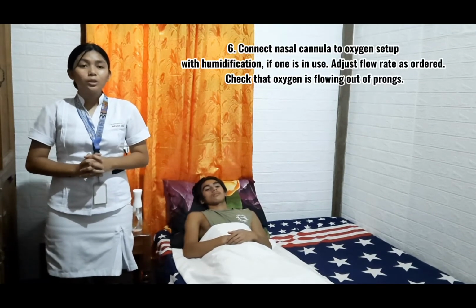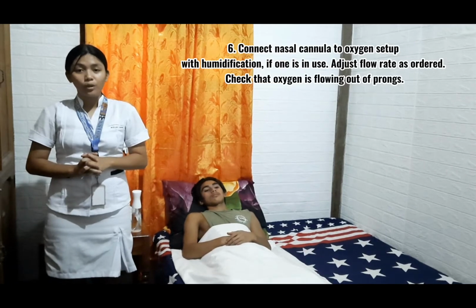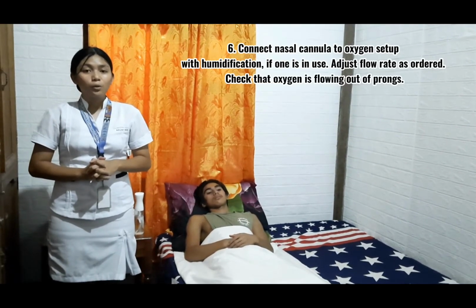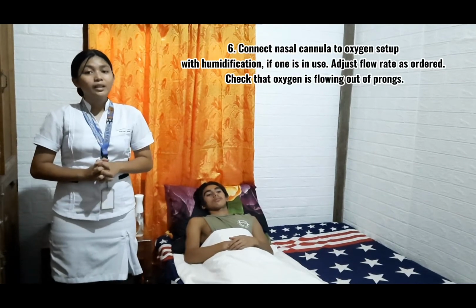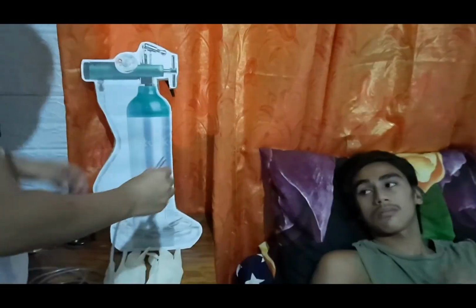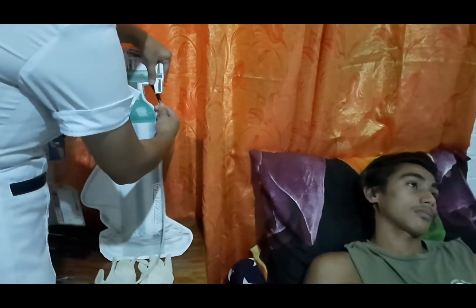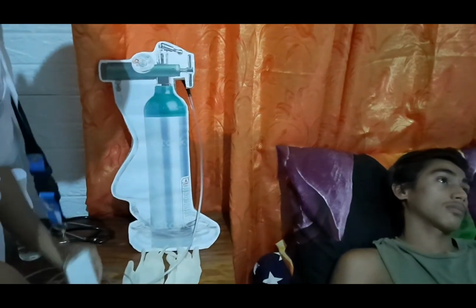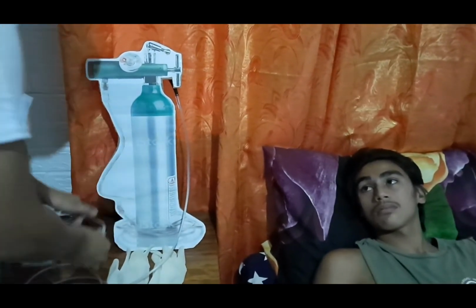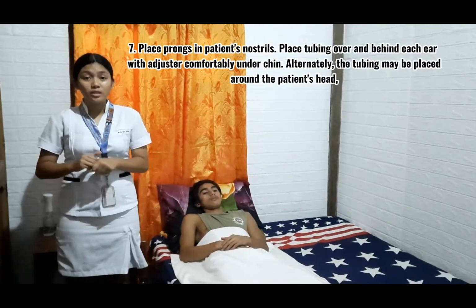Number 6, we need to connect the nasal cannula to the oxygen setup with humidification, if one is in use. Adjust the flow rate as ordered. Check that oxygen is flowing out of the prongs. Next, we need to place prongs in the patient's nostrils.